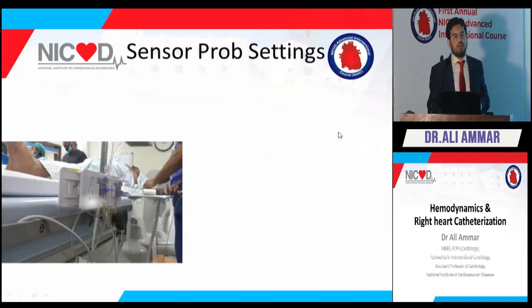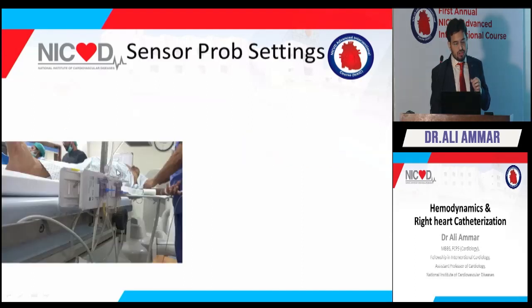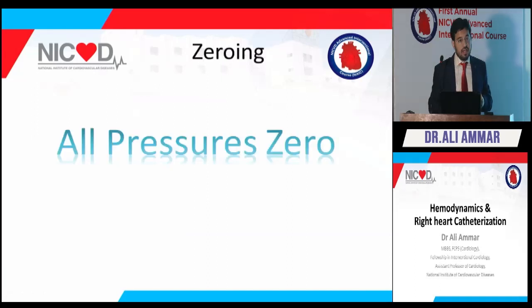So this slide is also important because we have to measure the pressures and they should be reliable. And for reliable pressure measuring, we have to do settings in the pressure probes here, and after doing it, we have to make sure that it is at the same level of the heart. Because if these pressures are not at the same level of the heart, we will not exactly diagnose the pressures. Another important factor, before going into the DAP, we have to make sure that all pressures in the scale, in the monitor, should be 0.